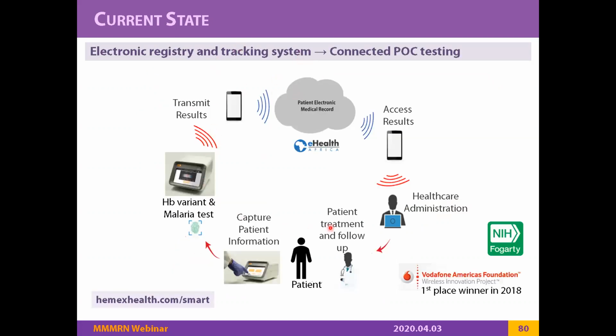This is another thing that we have been working on. This is making a smart infrastructure for the testing where the results can reach directly to the doctor and the patient via mobile technology. So this is another work we have done, and actually won an award in this competition, and we have been funded by this agency from NIH.